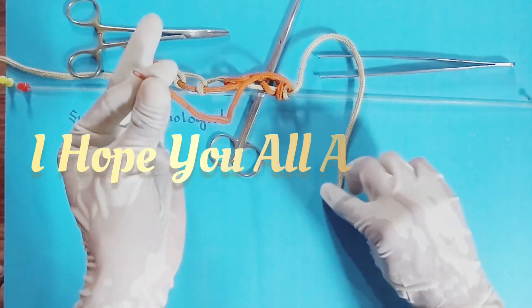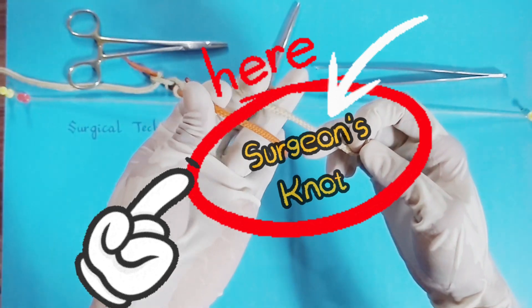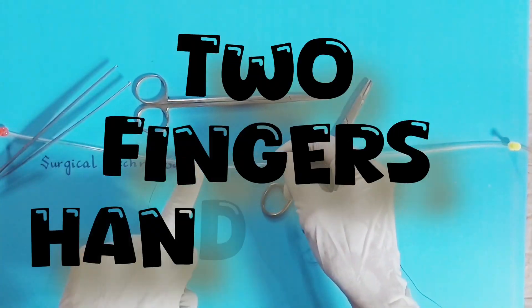Hello viewers! I hope you're all well. Here is the easiest technique of surgeon's hand knot, that is two fingers hand knot.